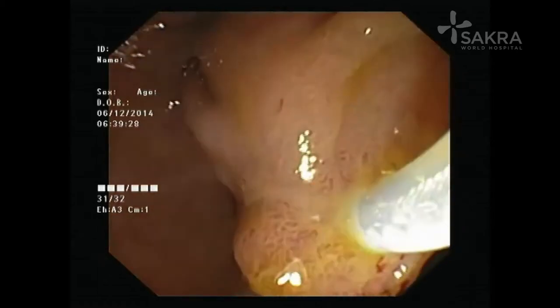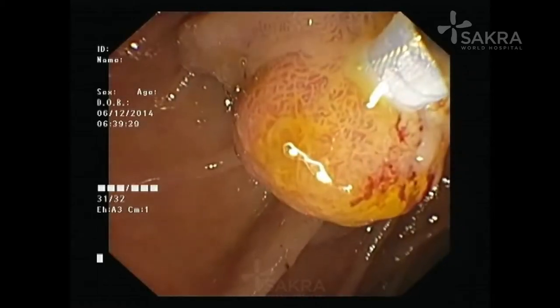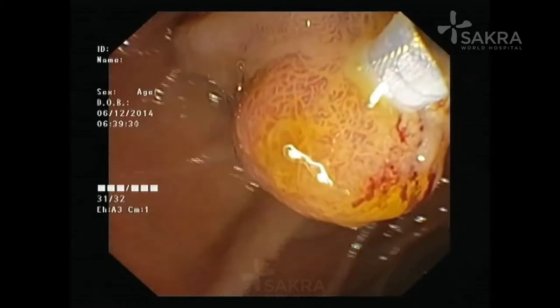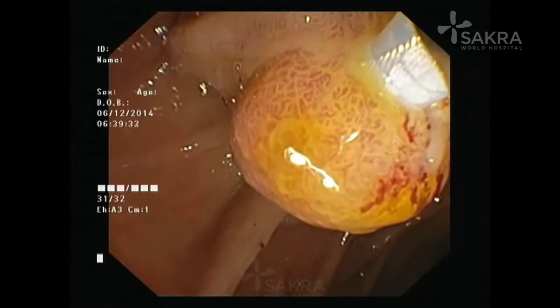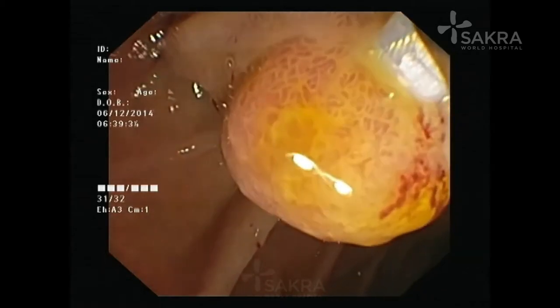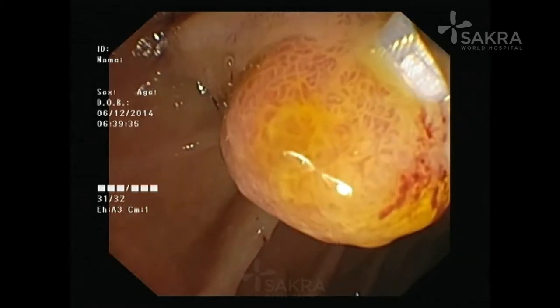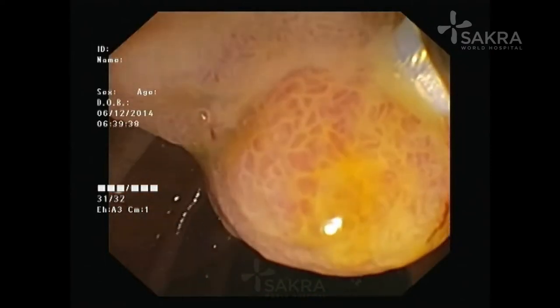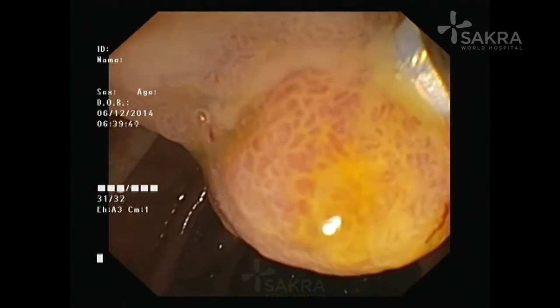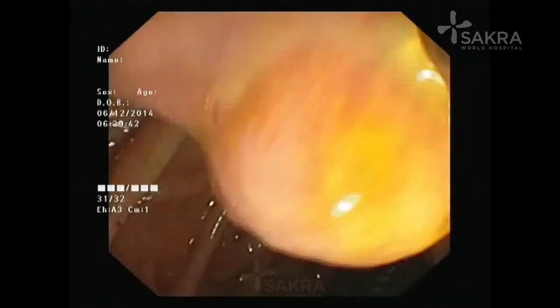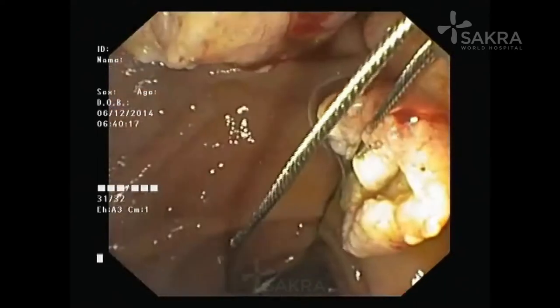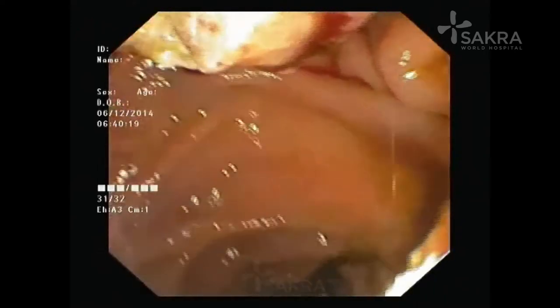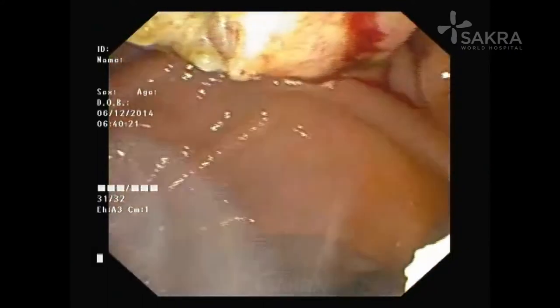We use a standard monopolar diathermy snare, which should ideally be soft and flexible. An en-bloc excision is the preferred approach. After resection, it is important to quickly retrieve the tumor tissue for histological examination, as delay may allow it to slip deep into the duodenum, making retrieval for diagnosis impossible.